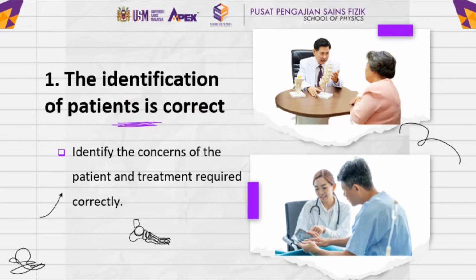First of all, we need to make sure the identification of patients is correct. Identify the concerns of the patient and the treatment required correctly. Since the treatment requires radioactive substances, we have to avoid any mismanagement or mistreatment to the patient.